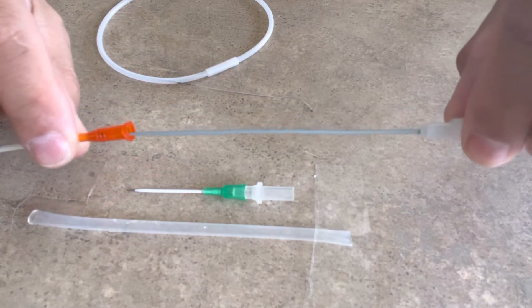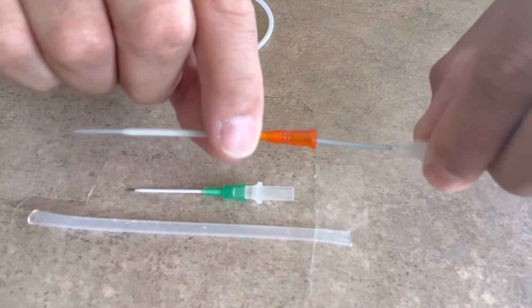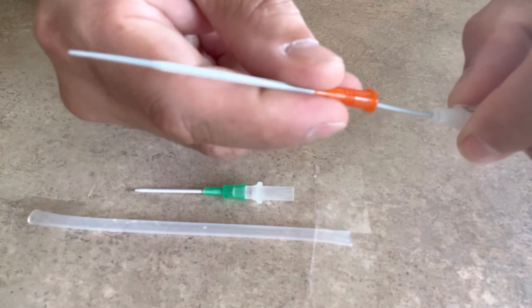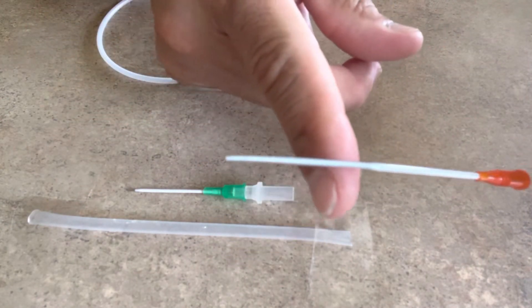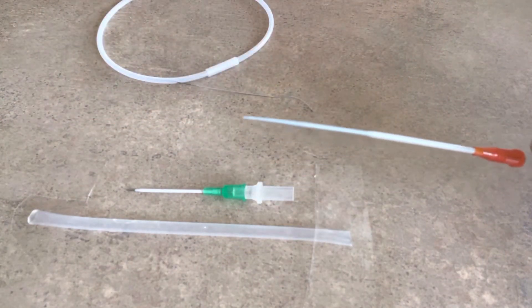And so interesting enough, through experimentation, I actually found out that this 14 gauge angiocatheter slides over perfectly and fits perfectly over this dilator.